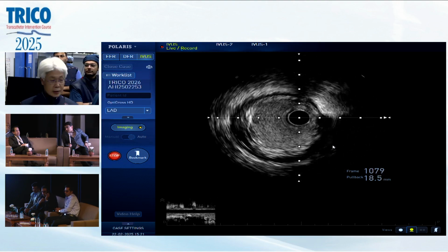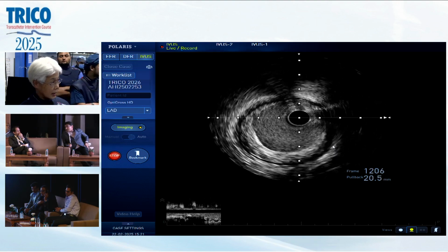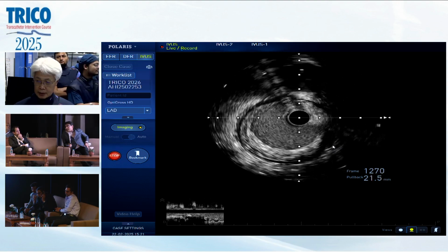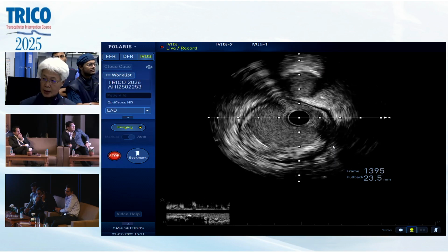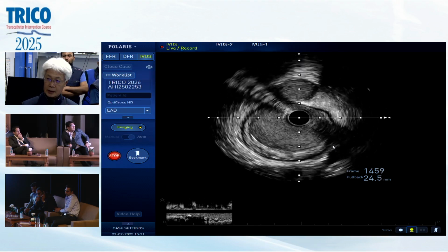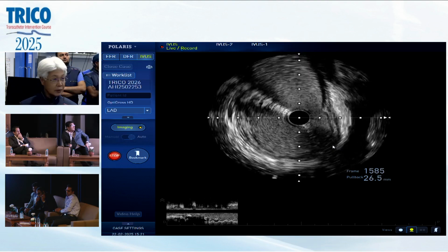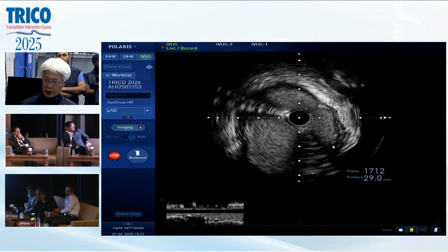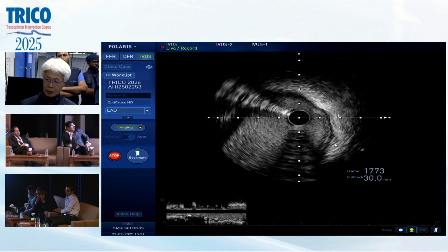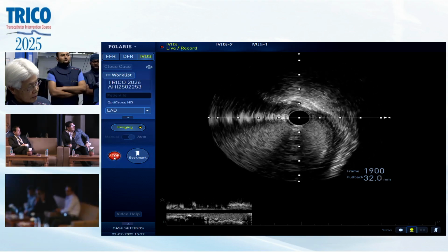So the main disease of the LAD is on the opposite side of the diagonal, right? Right here, still some plaque all the way to the ostium or a little bit. It's not that bad, okay? Right here, this is the ostium bifurcation. The left main is clean, coming with only a small amount of disease. Okay, all right, stop there.